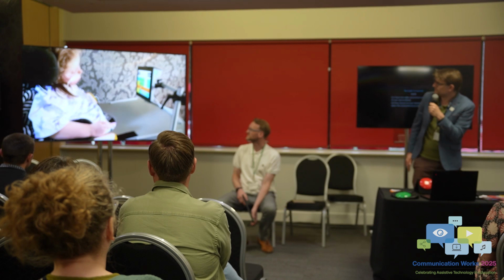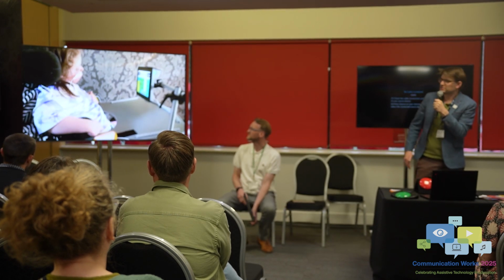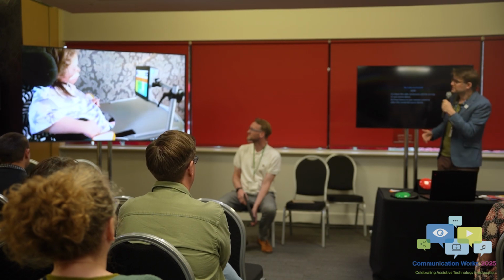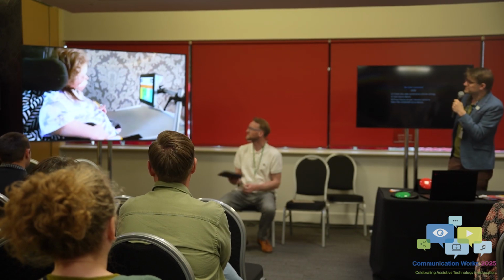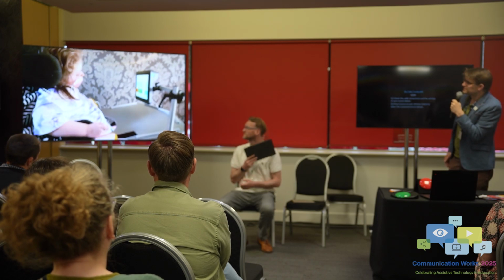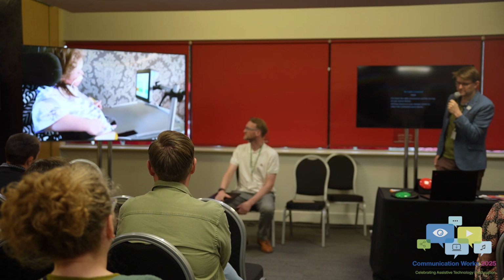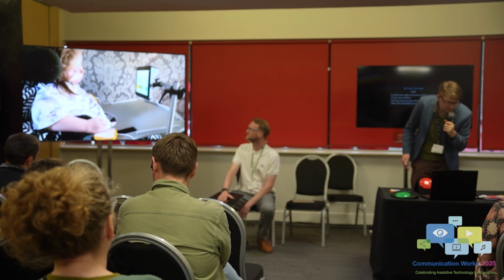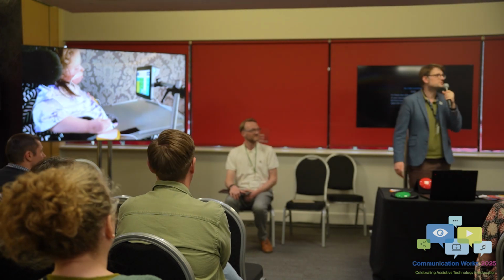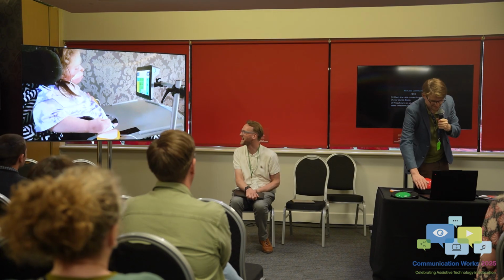Oh, here we go. She's done all of the practice with playing around with scanning. She's tried other things, and now she is scanning with this communication aid. Super cool. That looks good. Okay, she likes it. Good, thanks. She was talking about functional switching. She said she likes it, just FYI.